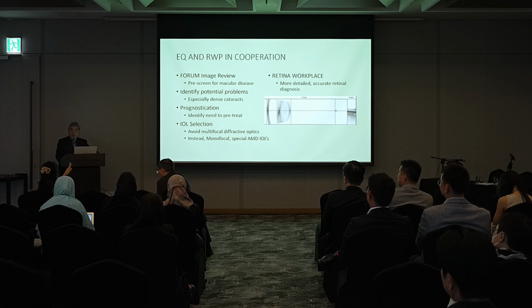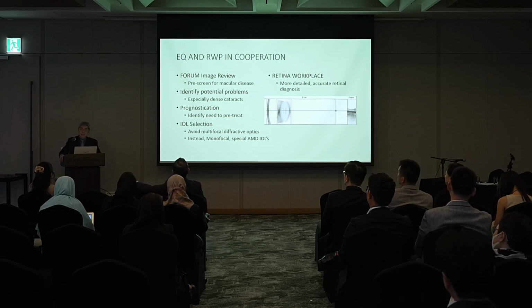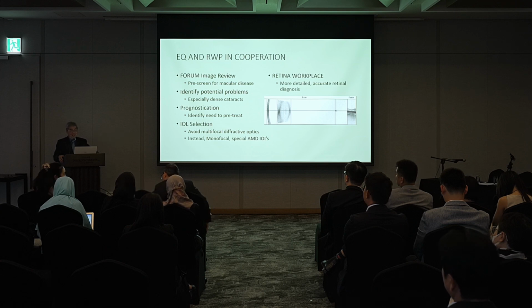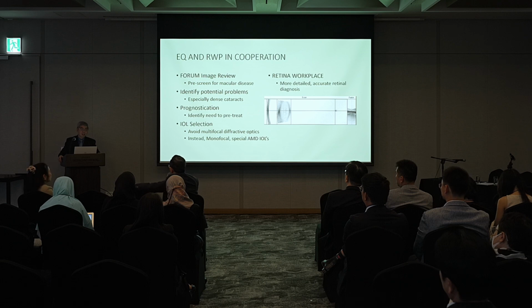I also do the screening a lot, especially if you're going to implant the multifocal lens. I totally agree that previous investigation should at least be through your eyes and make sure that everything's okay, instead of you accidentally or surprisingly finding out post-operatively. It's going to be a lot of trouble. Yes, Adrian? The same standard, I think, would be an OCT of both the macula and the optic nerve head as a form of screening.